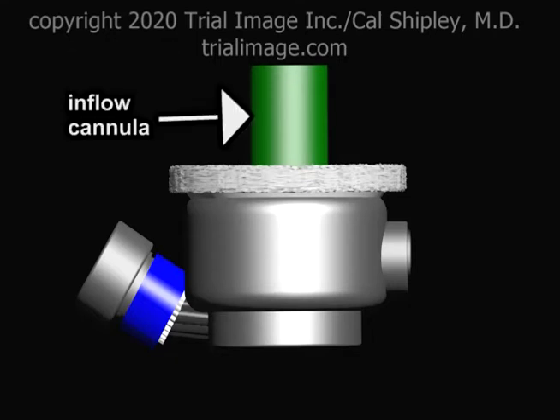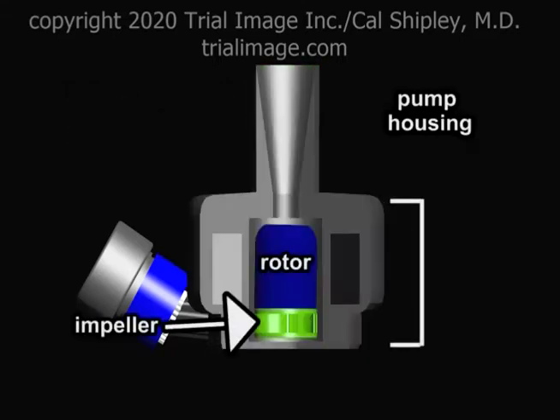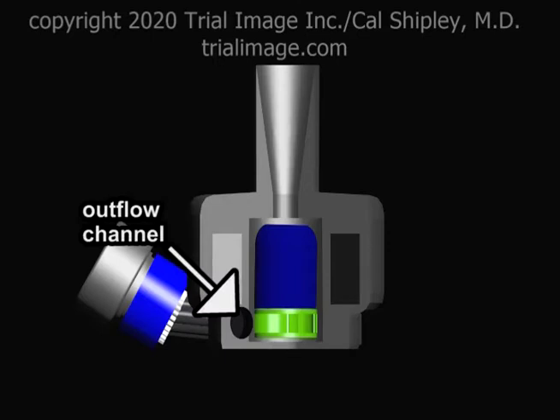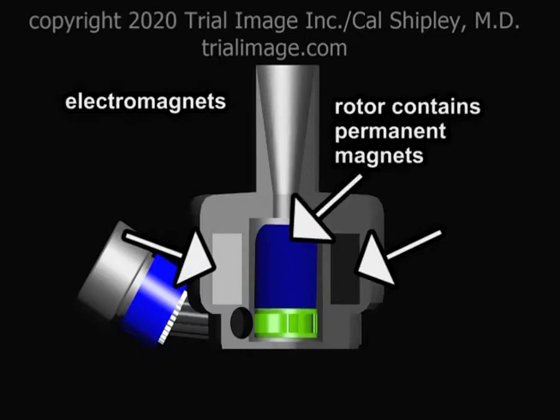On top of the pump is the inflow cannula, a hollow metal tube through which the pump receives blood from the left ventricle. The pump housing contains a rotor, which is attached to an impeller. The impeller drives blood into an outflow channel. The housing contains electromagnets, while the rotor contains permanent magnets.